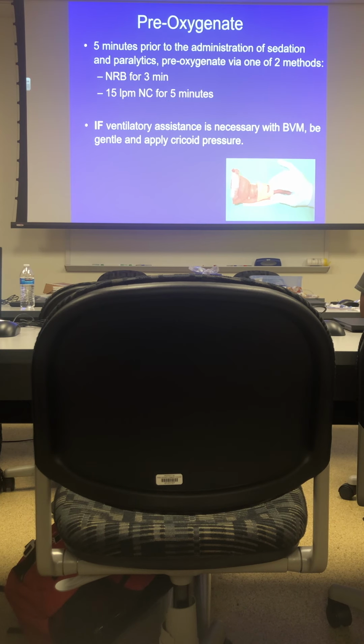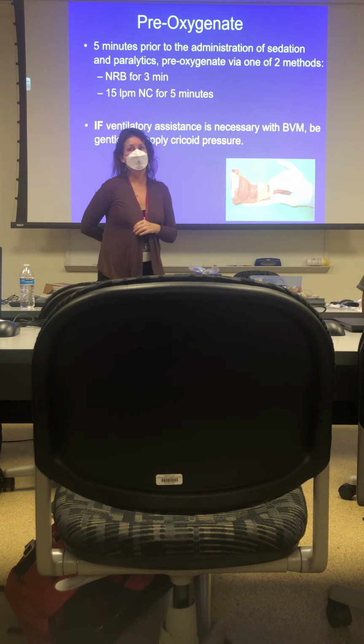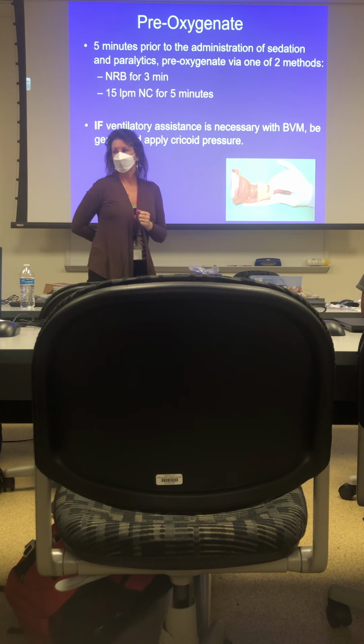On a nasal cannula, how many liters do we go to on a regular normal nasal cannula? You guys have to review before you start clinicals. They're going to ask you all this oxygen stuff, your instructors, and you need to know it. Nasal cannula. Can I go to 1 liter?